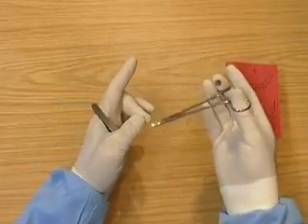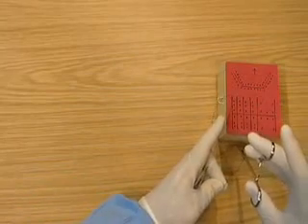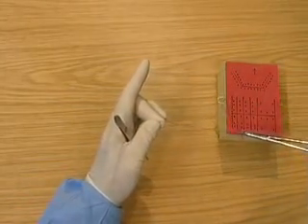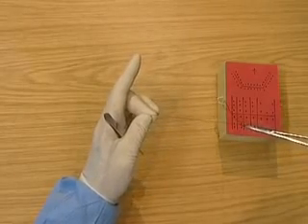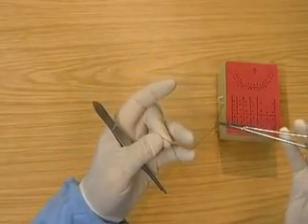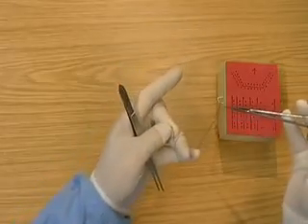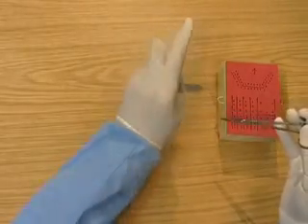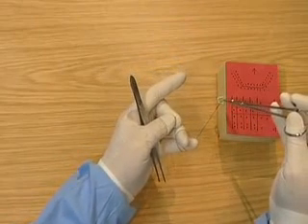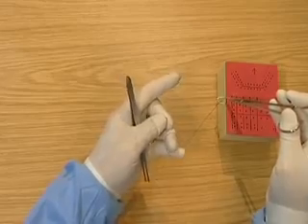Go over, over, and then taking the needle holders through the knot and winding on as you run the knot down onto the staple, occasionally pulling with the right hand just to help the knot slide down.